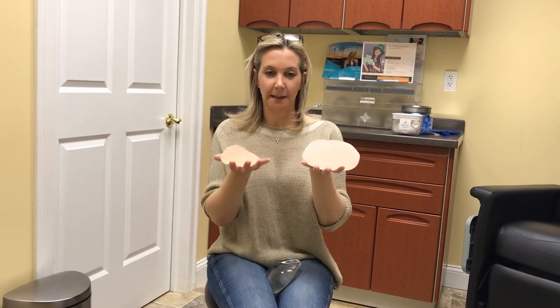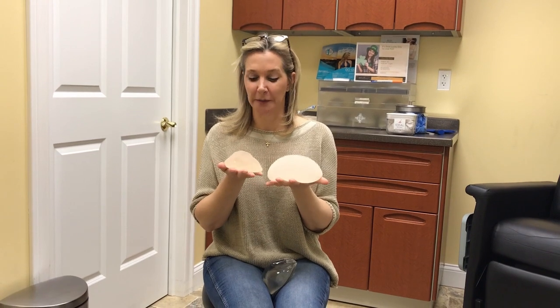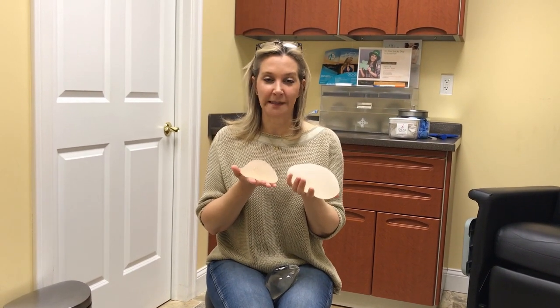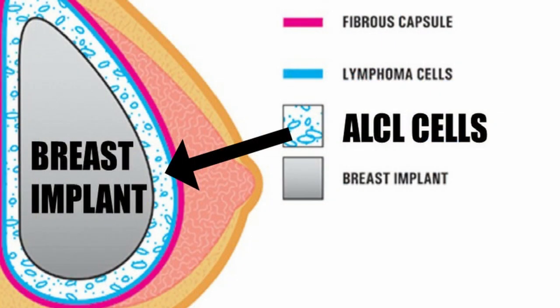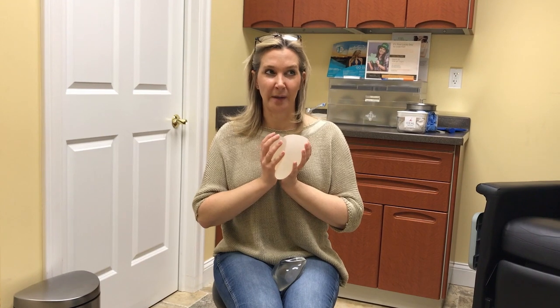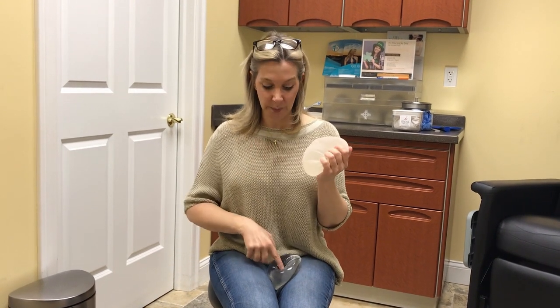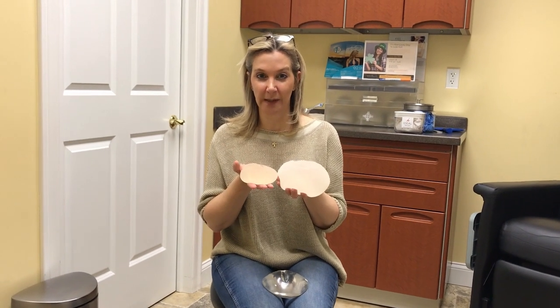So why don't I use these implants? I don't use them because of the texture on the surface. If you paid attention at all to augmentation surgery or breast implants, you may have heard of ALCL, which is a lymphoma that is associated with breast implants and is almost exclusively found in that patient population. And it's an exceedingly rare condition, but the vast majority, I would say 99% of cases, there may have been one or two cases with smooth implants, but all those people had some sort of texture in them prior to the smooth implant. The vast majority happen when ladies have had textured implants placed.